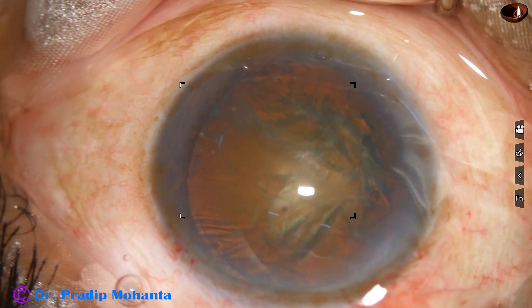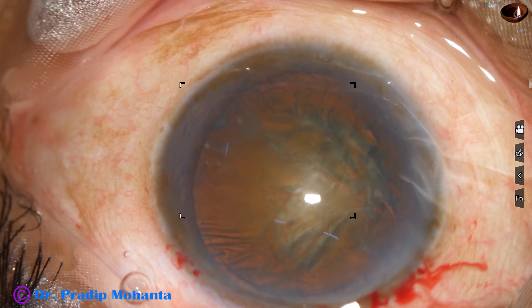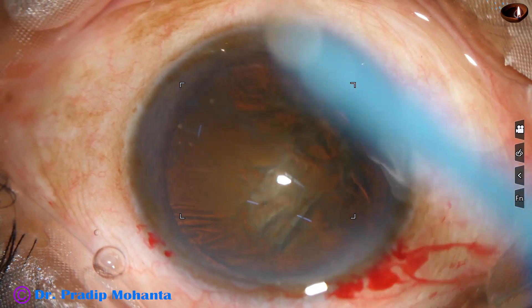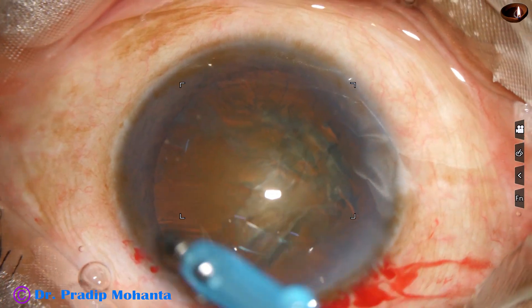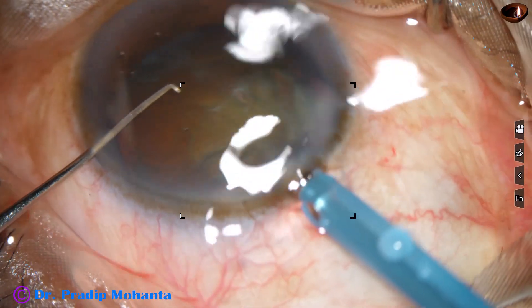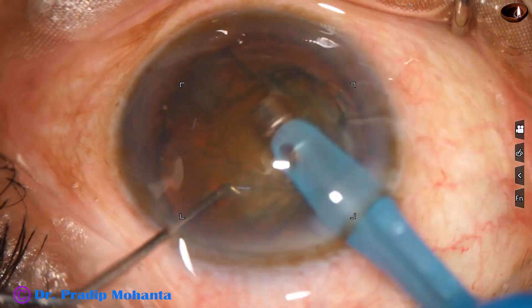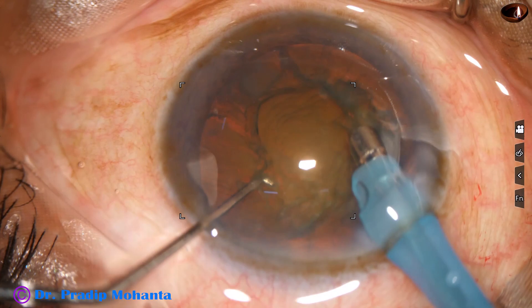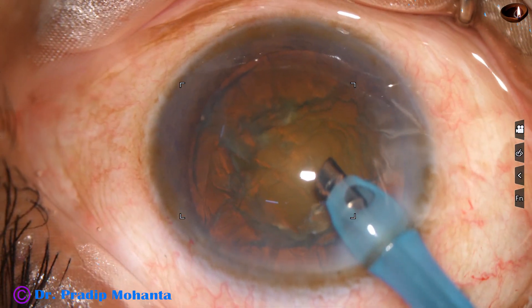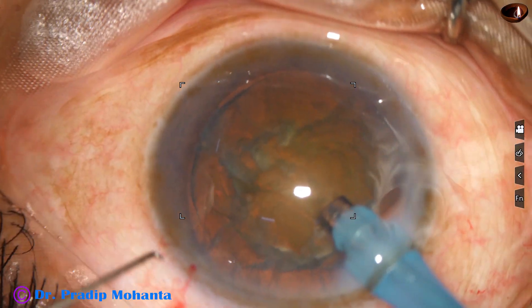Viscoelastic is again filling up the anterior chamber. The phaco needle is introduced into the anterior chamber. The machine being used is Oertli Cataract 3. The phaco needle goes in with its bevel down. Some superficial lens matter is removed, and then the phaco needle is turned to make the bevel up.